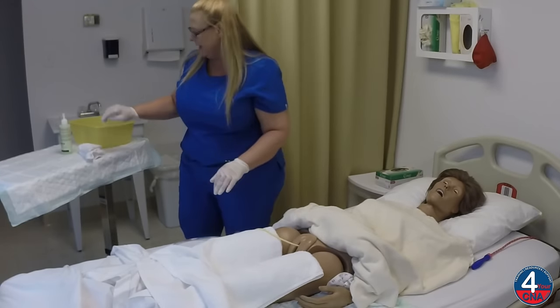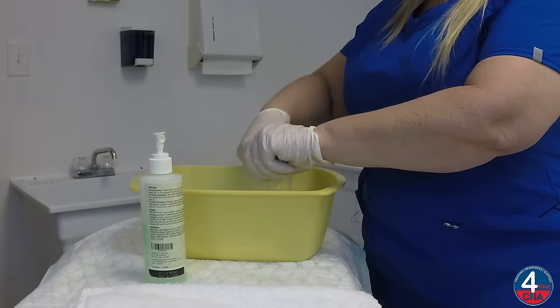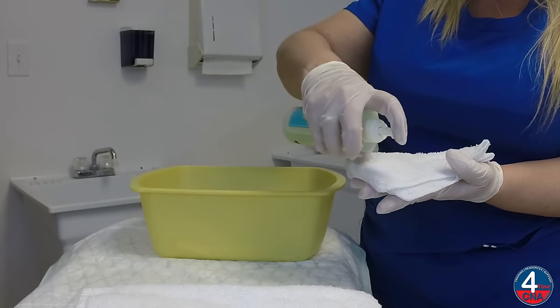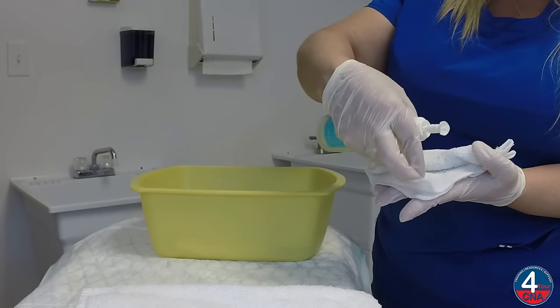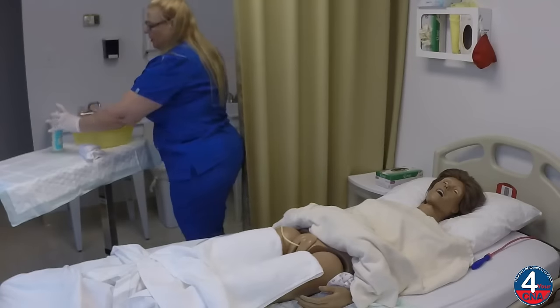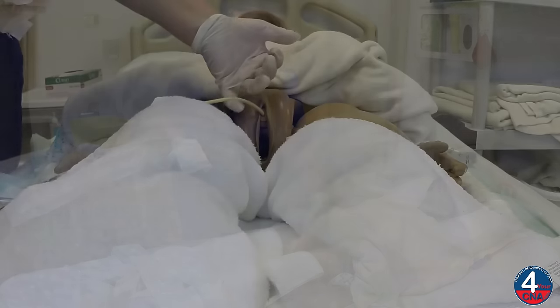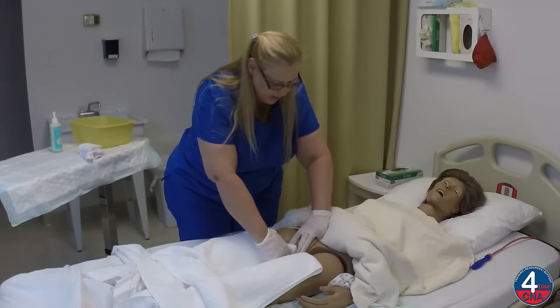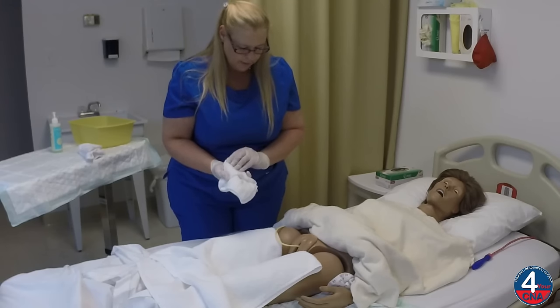Now we're going to do peri care. We'll take a washcloth out of the basin, wring it out really well, and we're going to soap five corners: one, two, three, four, and the back side is five. Now I'm going to clean the peri area. I'm going to lift the catheter up out of the way with my pinky and hold the labia open while I clean down the center with the first leaf, always going top to bottom, and then remove the washcloth and fold that leaf over.